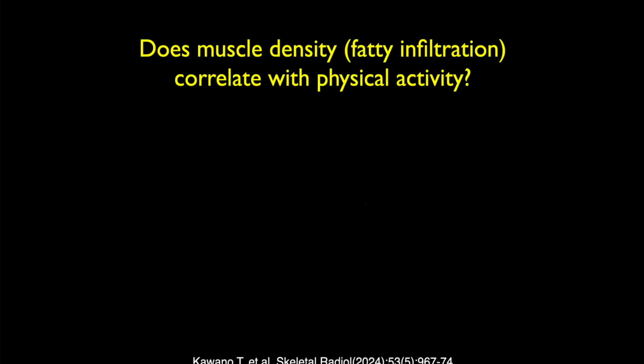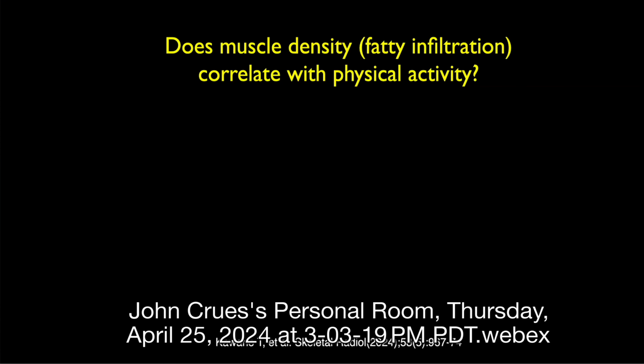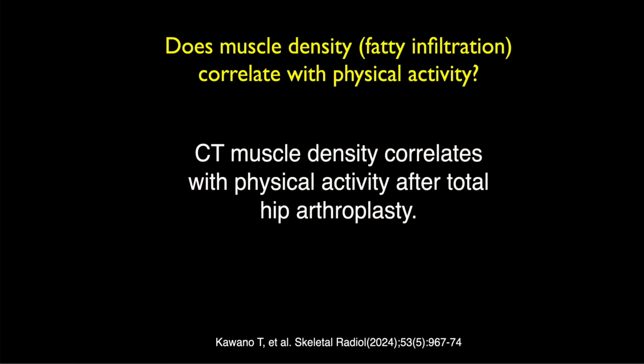So let's start here. Dan, does muscle density, that is fatty infiltration of the muscle, correlate with physical activity? Feels like a trick question, but I'm still going to say yes. Okay. Yeah, on CT, it does correlate with physical activity.